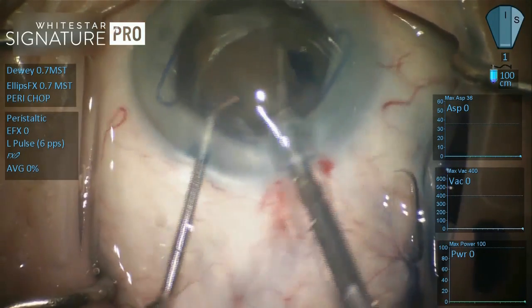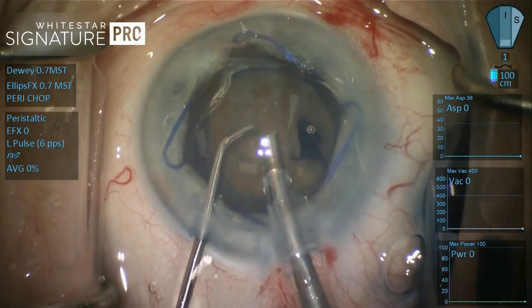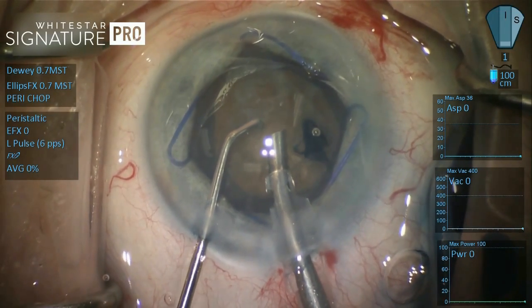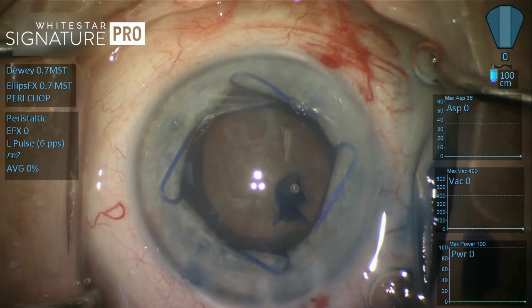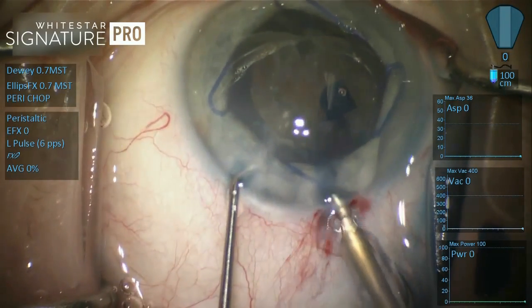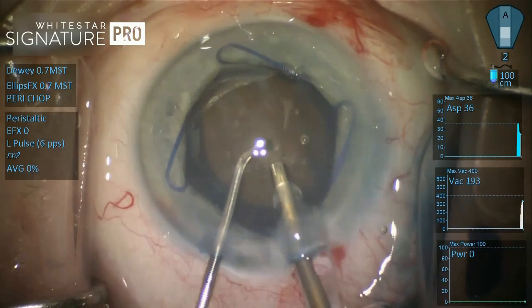Now, a lot of surgeons would advocate that a sharp edge in a dense cataract like this is going to provide an advantage, and I really don't think so. I think it comes down to technique and technology. I will respectfully disagree, and I much prefer the safety of the rounded edge. So I asked them to look again, and in the original packaging, we had a brand new 30-degree straight Packard Dewey radius tip from Microsurgical Technology.